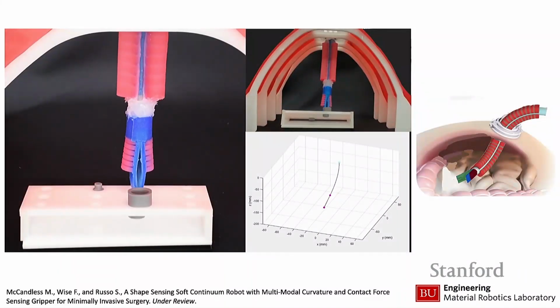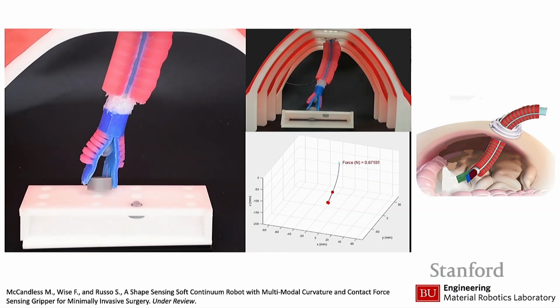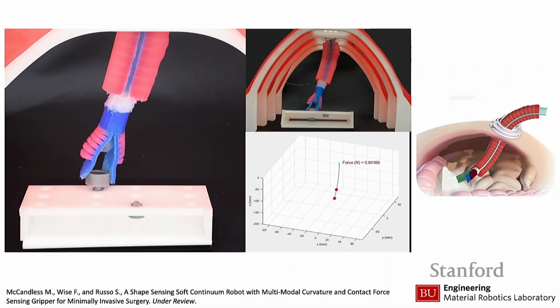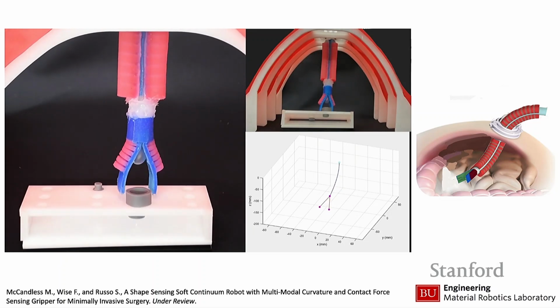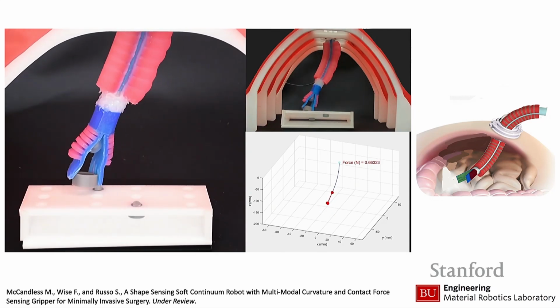The cool thing about this robot is we're looking into potentially having it applied in minimal invasive surgical applications. So, for example, a scenario like this in laparoscopy. And so we were able to test this. This is recent work that we currently have under review. We were able to test this in a sort of like pick and place peg transfer task scenario, where we pick up an object and we move it from point A to point B.